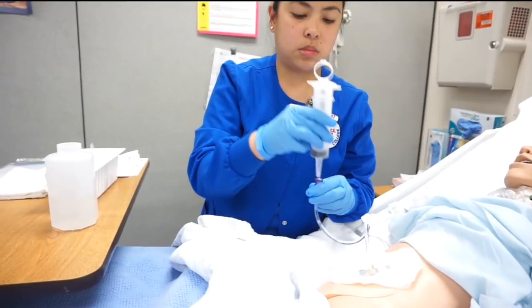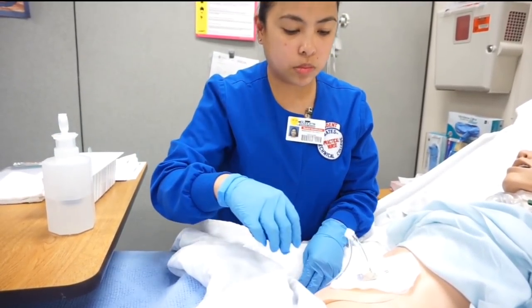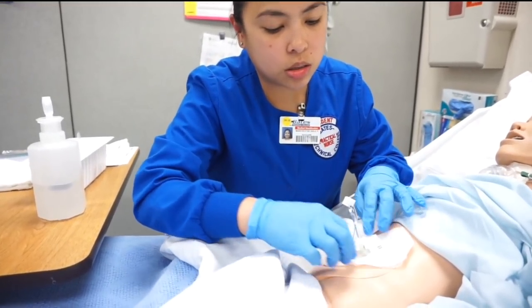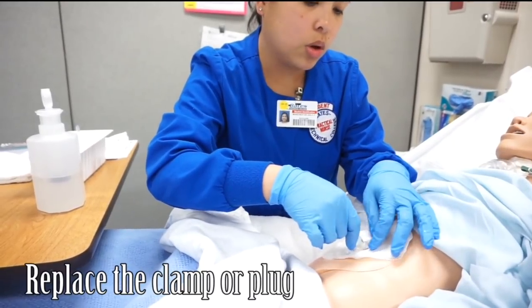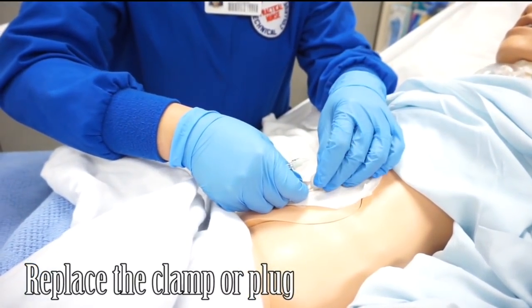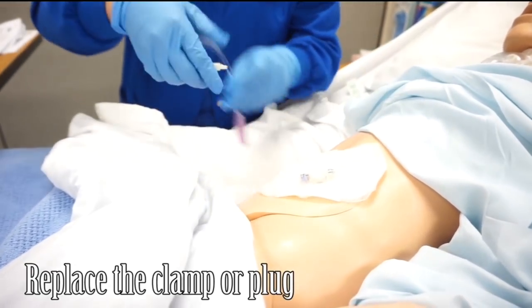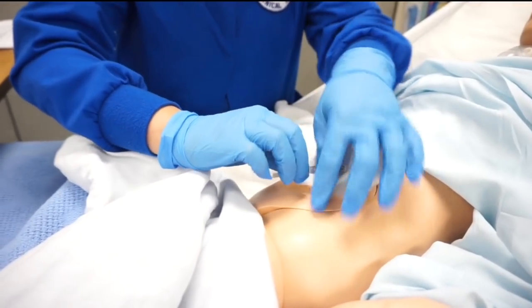Going to lock this. Now what I'm going to do is inspect the site. I'm going to remove the tubing, take it off, lock it, and then remove the gauze.